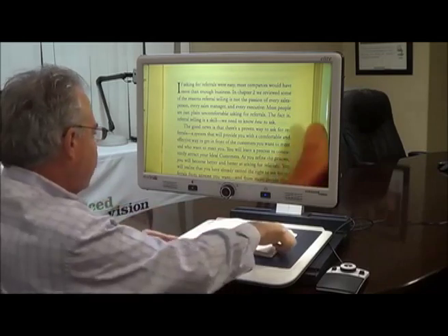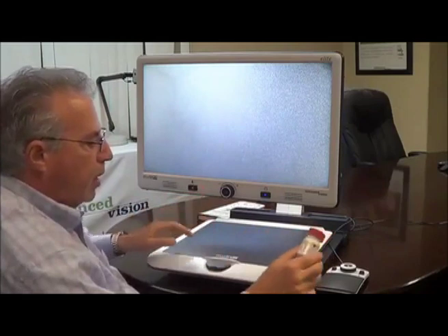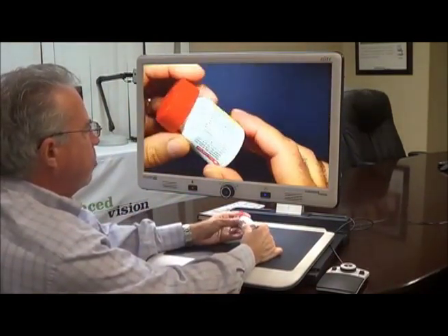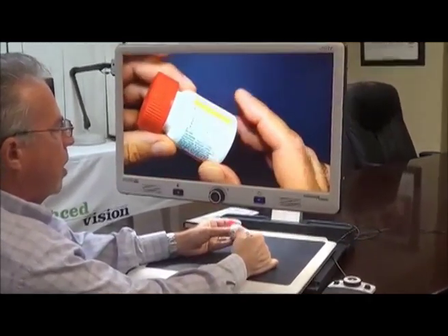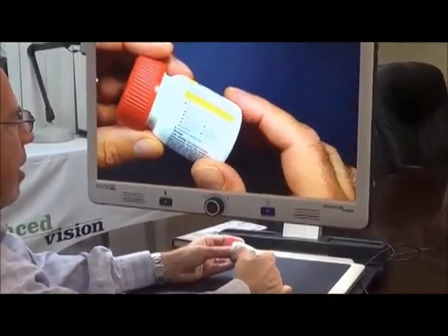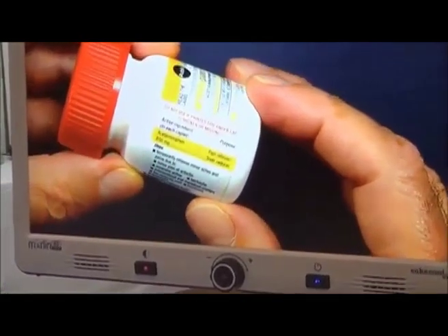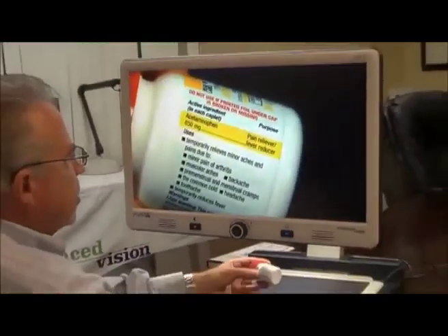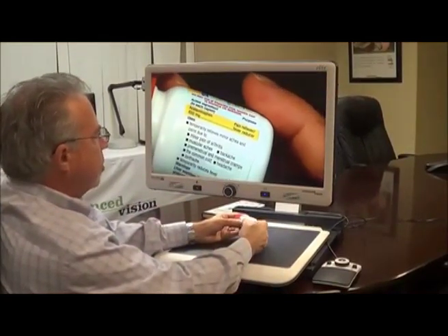To show you the versatility of the Merlin Elite Pro, I have a pill bottle. Many of our customers may take medication, and reading the pill bottle is often quite difficult. So here's an example of not only the quality of the picture, but also how easy it is to use. This is just a pill bottle that you can look at on the screen. You can adjust the size. In this case I have it in full color, and you can easily see the information even though it's printed quite small.